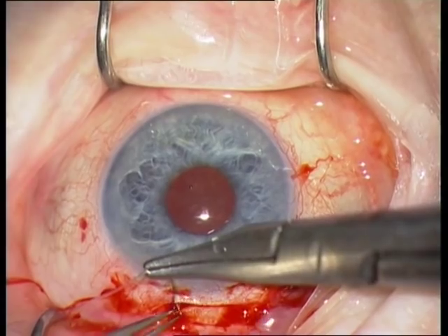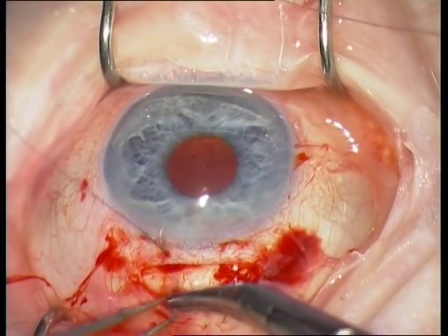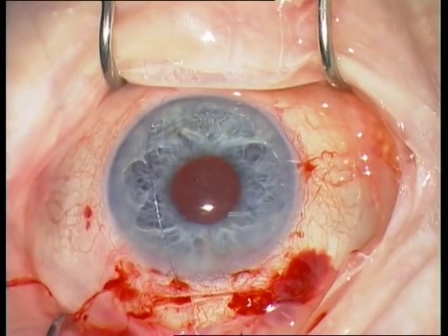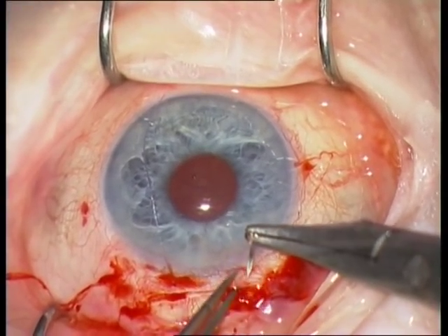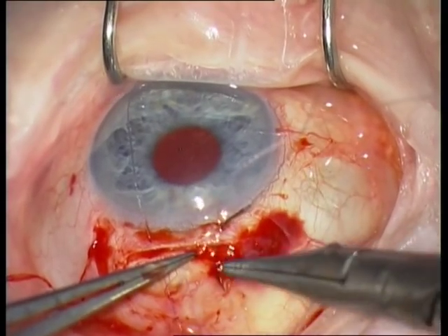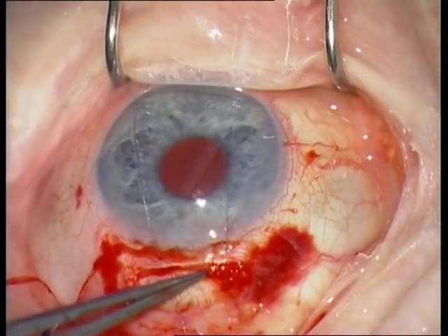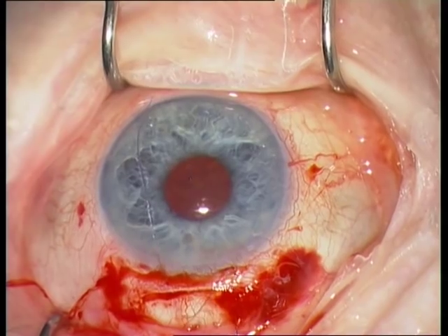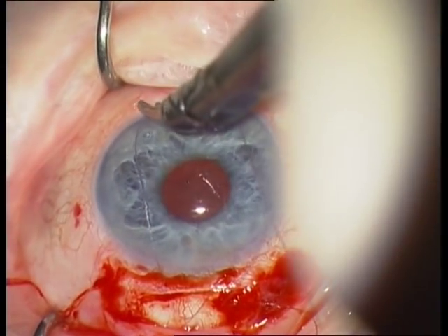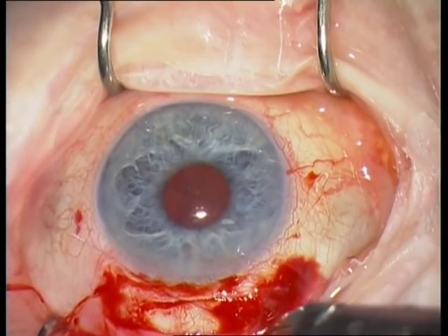Then close the frown incision with a Vicryl 8-0 cross stitch. This step is maybe not necessary — the frown incision is actually water tight — but I prefer to do this step to sleep better at night. I would definitely not perform more than one cross suture, just to have form stability of this broad incision. Don't pull the suture tight; you don't want astigmatism. Only a light tension to have a form-stable tunnel incision.